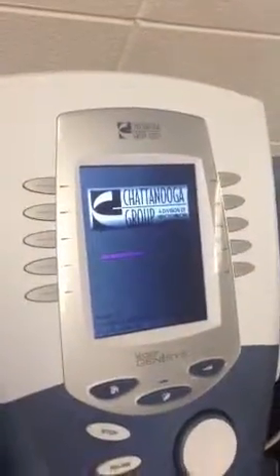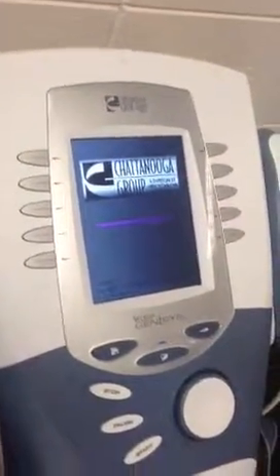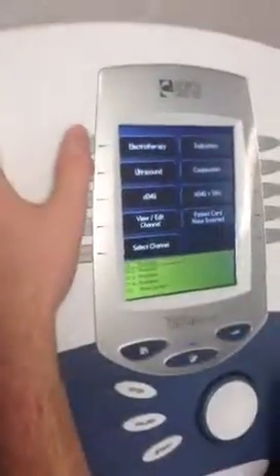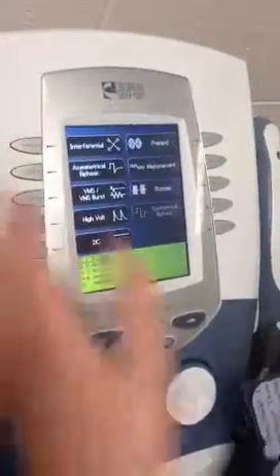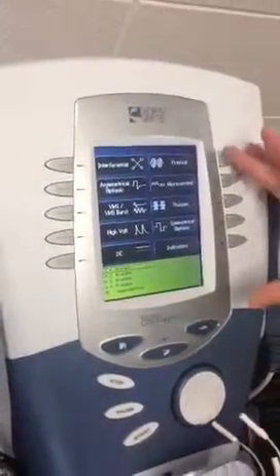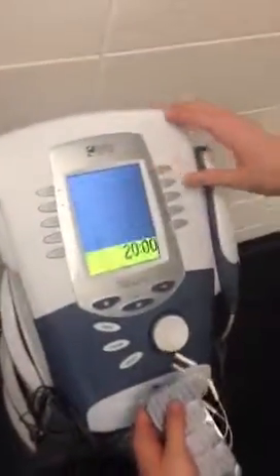Going on from this, I would turn the machine on. Just push it back against the wall. And to start, we're going to start with premod. So we will need 2 pads because IFC requires 4. So going in the machine, I would look into electrotherapy, and as you can see, there are all the different E-stim modules in here. So the first one we're going to do is premod.